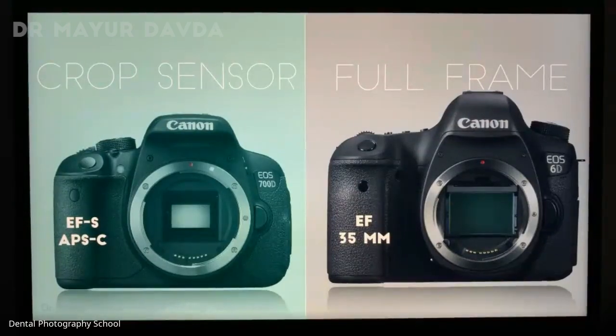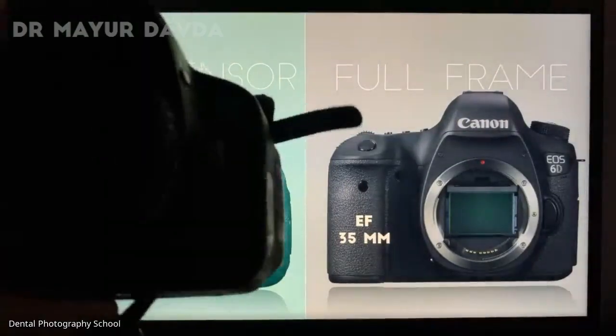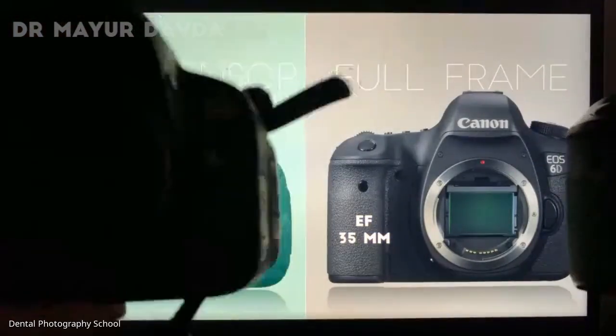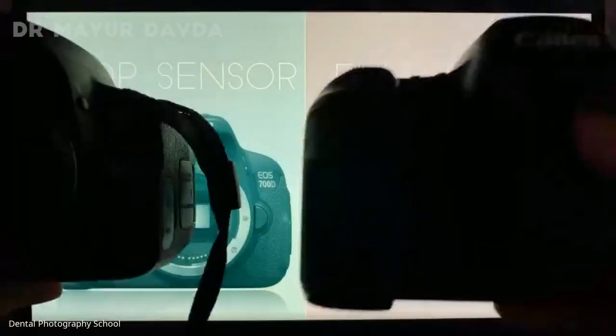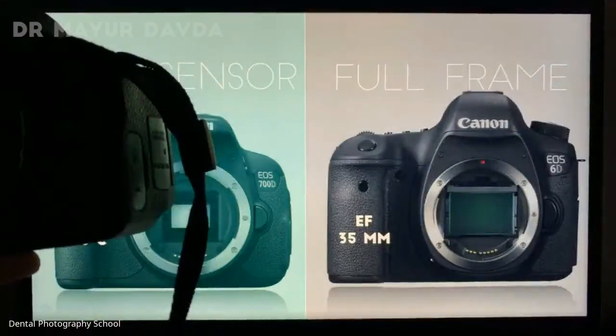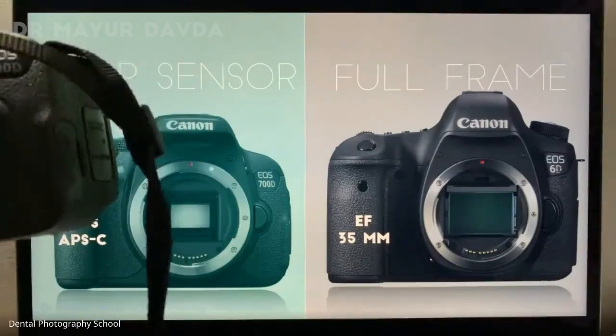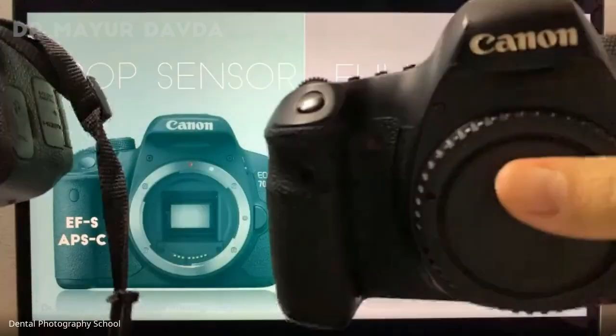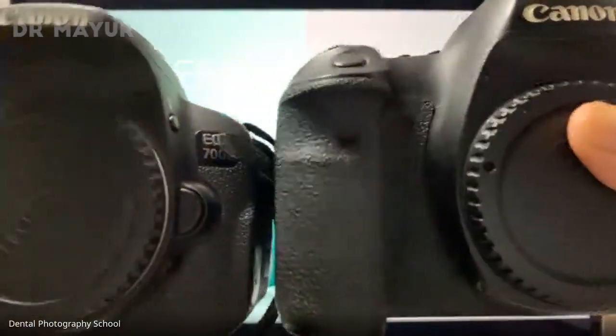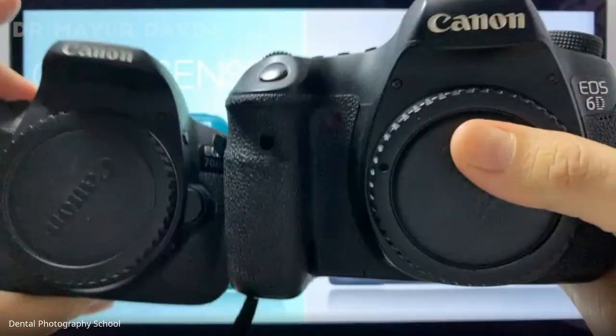Basically there are two types of cameras. One is a crop sensor camera and one is a full frame camera. If you really want to see it live, I have both of them right in front of you. The camera on your left hand side is a 700D. It's a crop sensor camera, and this one is a full frame camera. I'll put the lights on so that you can see it well. This one is a 700D and this one is a 6D, the full frame. So these two are the cameras on your screen right now.